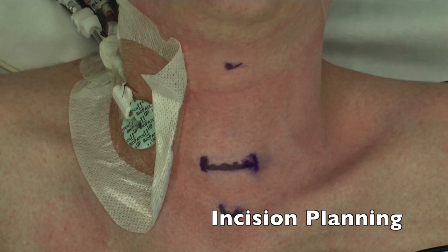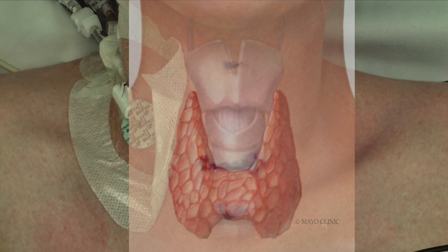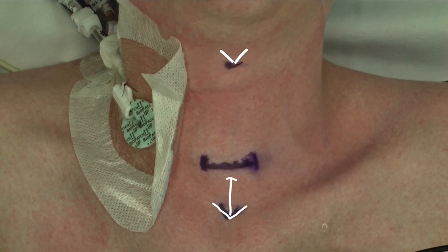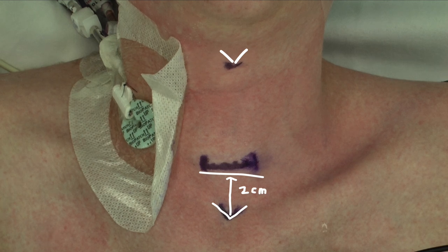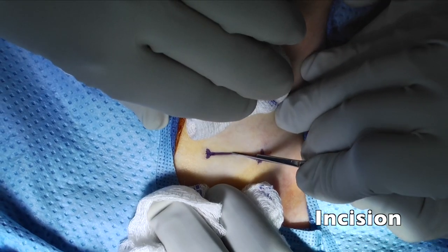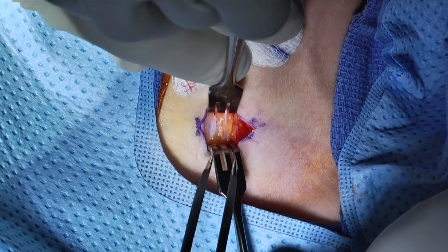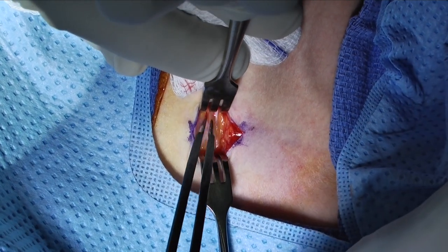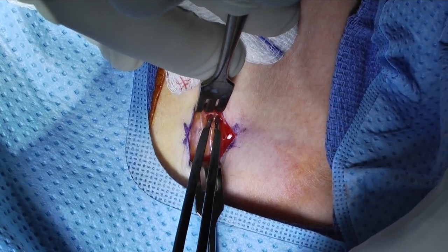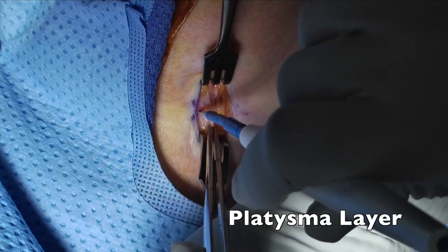For incision planning, the first steps involve palpating structures that are known. This includes the thyroid notch and the sternal notch. The incision is then placed approximately two centimeters or two finger breadths above the sternal notch in a skin crease. After local infiltration, the incision can be made down to the dermis, and then subsequent subcutaneous tissue is dissected using bipolar cautery, unipolar cautery, or Jones scissors.